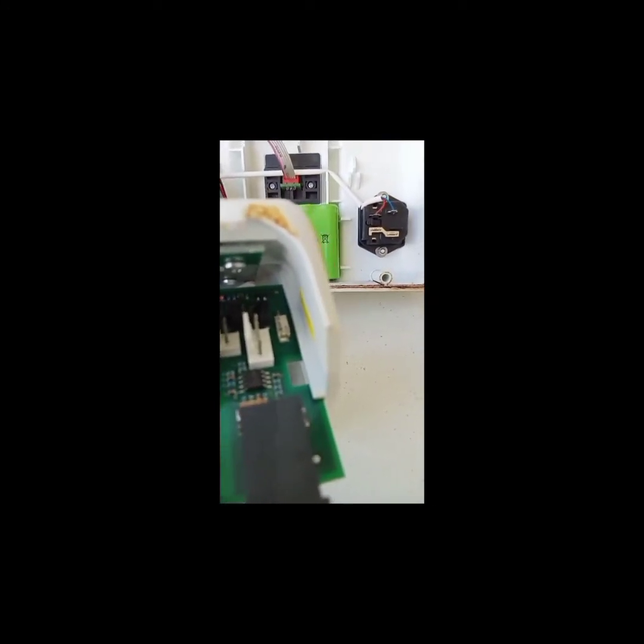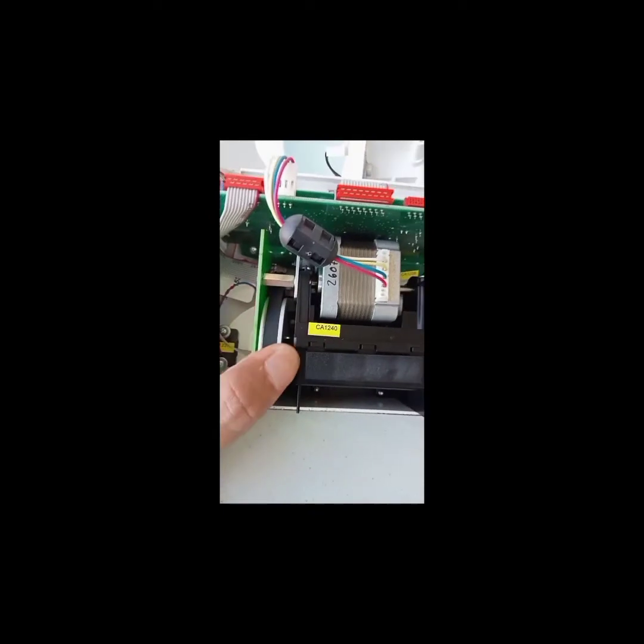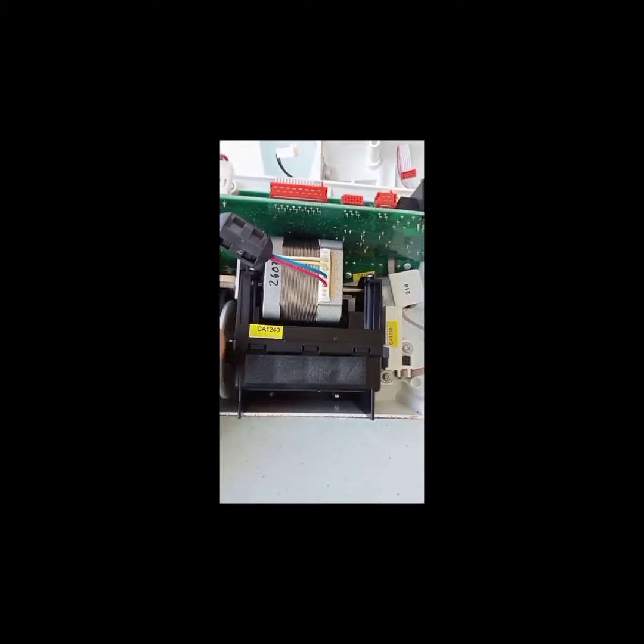Now, we're going to check up the battery, and we will try also to check the fuse right there, that white one embedded in the circuit. Okay, also these capacitors, I hope they're in the right value. And actually the belt, I think it's okay. And the bearing, I think it's normal, the rotation is normal. Okay, we're going to check it up.